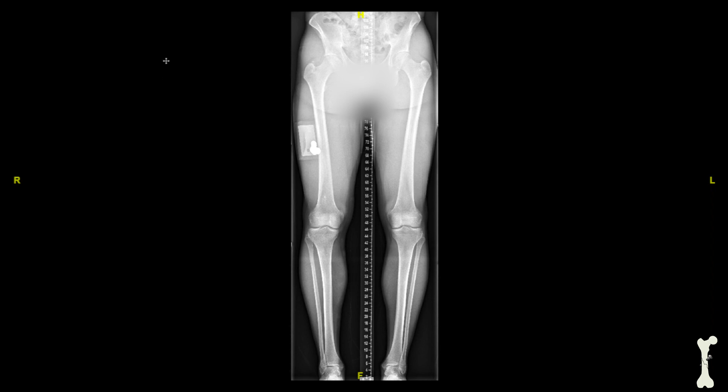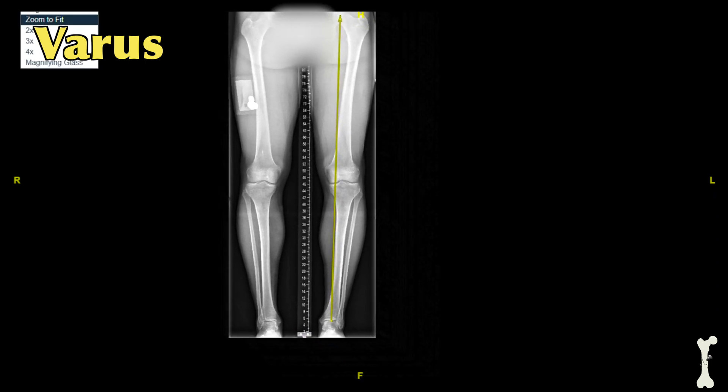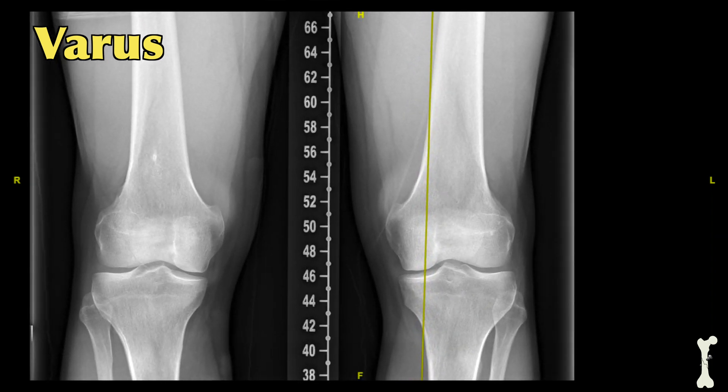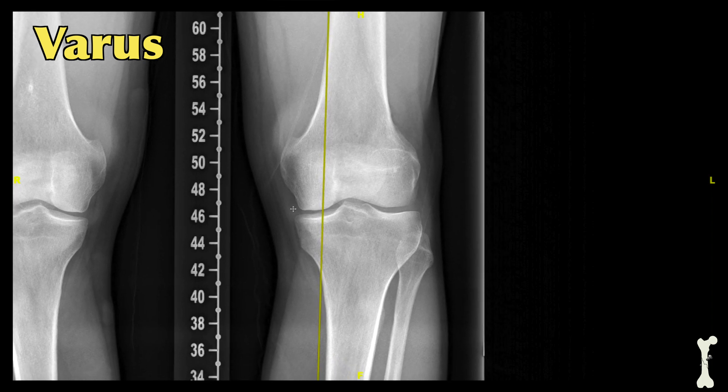In this next patient we're going to draw the mechanical axis as well, but the difference is that this patient is in varus or bow-legged alignment. We'll start by drawing the mechanical axis through the extremity, starting at the center of the femoral head, then drawing the line down past the knee joint to the center of the ankle joint. Zooming in on the knee, we can see that in this particular patient the mechanical axis passes through the medial side of the knee — the inner side of the knee.